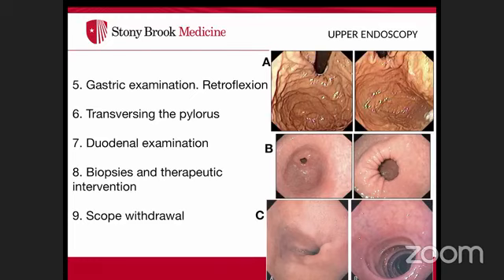The retroflexion maneuver lets you view the GE junction from below and examine the fundus of the stomach. This is important for identifying hiatal hernias or other lesions in the upper stomach. Then proceed to traverse the pylorus.